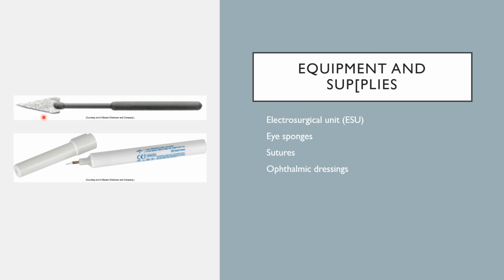And this here is what one of those cellulose sponges will look like. So this tip would go just directly into the fluid, not touching the tissues, and it will wick up that fluid. And you'll usually use several of those in the course of a procedure.